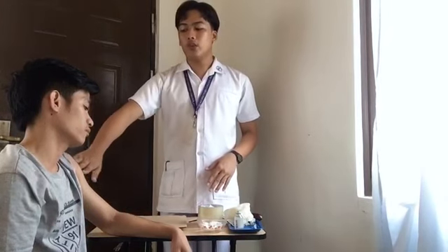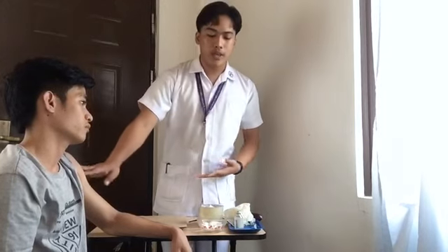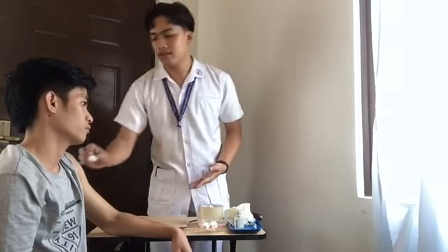So next is select, locate, and cleanse the site. So I am going to select this site, which is his deltoid muscle, and I am going to cleanse it using the swab cotton balls. Okay, I'm going to discard this cotton balls.